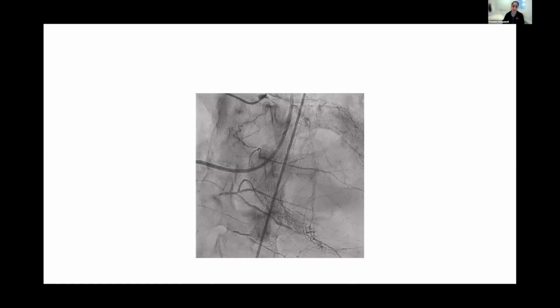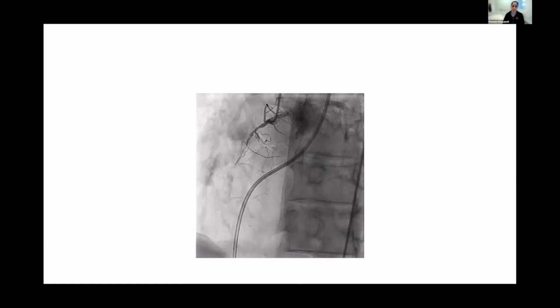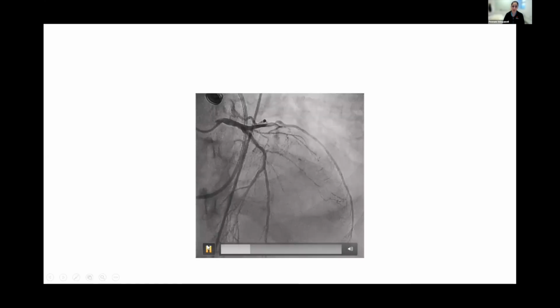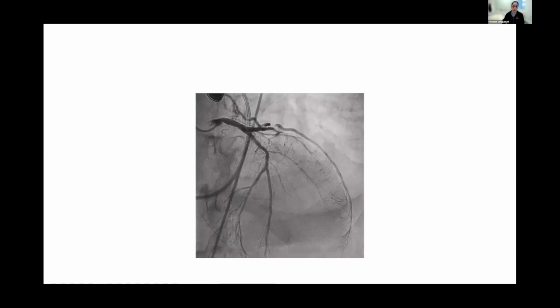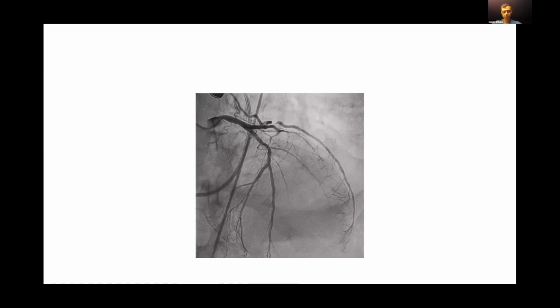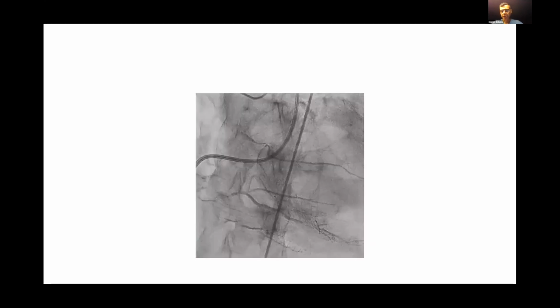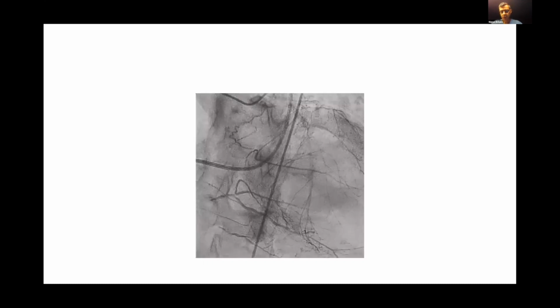I could definitely image that lesion, but without physiology, imaging wouldn't really mean anything unless it's way too significant. So I would start with physiology, though I don't know if I would trust it very much, but have a discussion with the patient as to what the long-term plan should be, a PCI or a CABG. That LAD will be significant by physiology, it appears. Absolutely, and it's well known that if you stent the CTO, then the FFR of the donor vessel will increase by 0.03 to 0.10, so it can have a significant impact on what your FFR on the donor vessel is going to be.